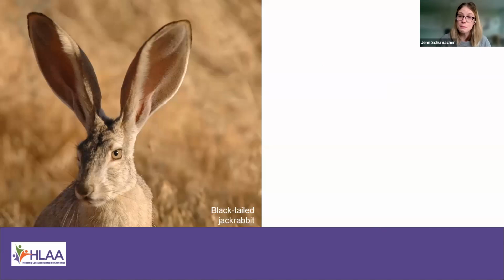So let's get inspired by nature a little bit. I've got a picture of a jackrabbit here, and you can imagine with these huge, beautiful ears of his, it's almost like he's got his own set of microphones on his ear. So when we talk about microphones in hearing aids, we call them directional microphones because it's literally almost like these two big rabbit ears that help kind of zero in on what you want to hear.